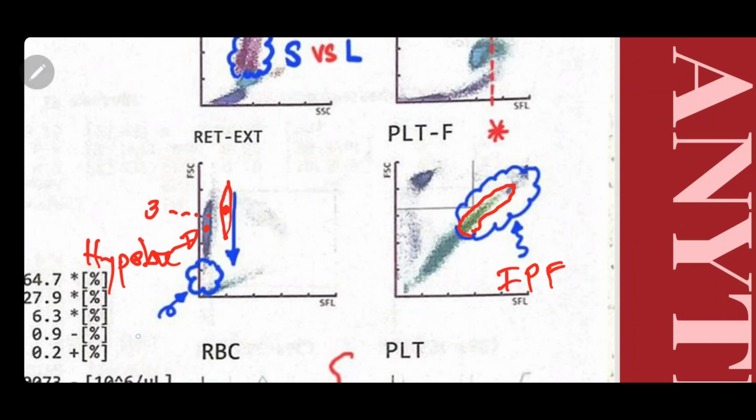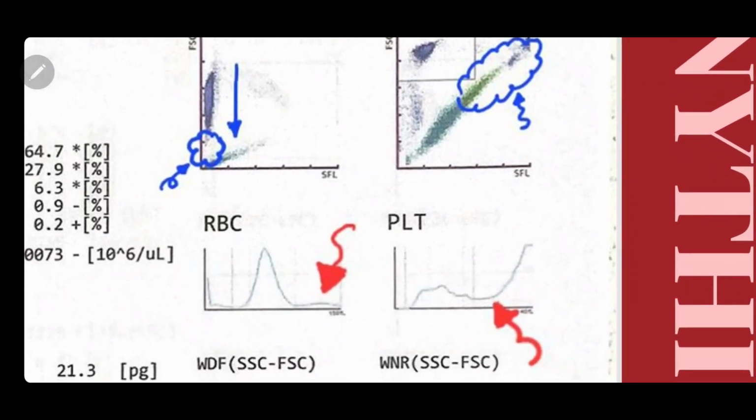Do you see it? And what do we find here? We find fragmented RBC in this area as well. Let's look at the graph further. The simplicity of interpreting this graph makes it easier, but this case is slightly more complex. What we observe is the tail of the RBC curve rising. It does not drop to zero.